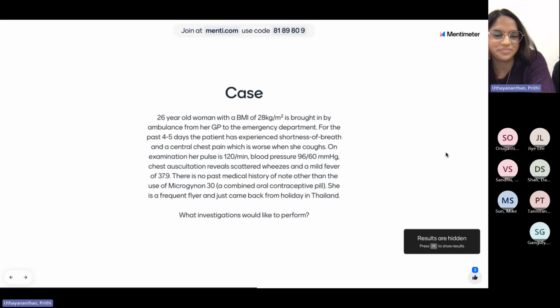It's probably the ones we were talking about today. Yeah. So you would probably, using an A to E approach, which will definitely get drilled into you later on this year, want a chest X-ray, ECG, and ABG as your basics. As soon as you see the patient, if there are unstable observations, you'd want to get those, and bloods and things like that as well. We're going to focus mainly on just the ones we talked about.